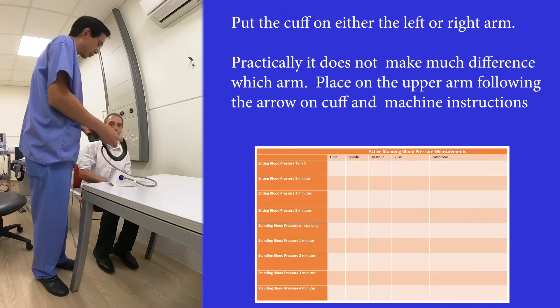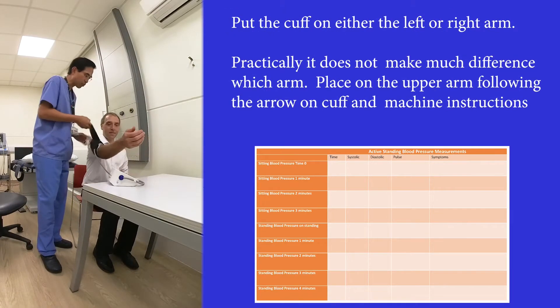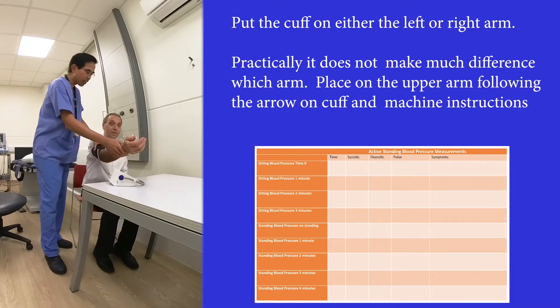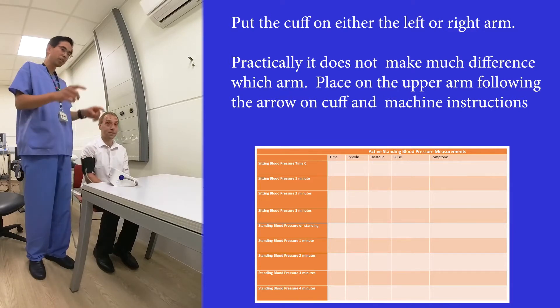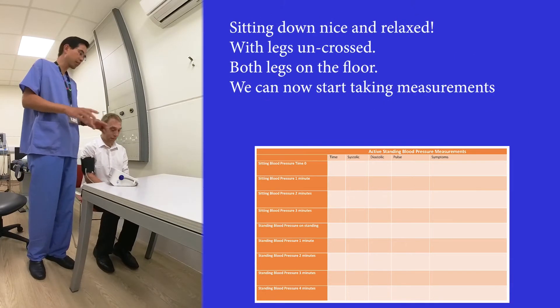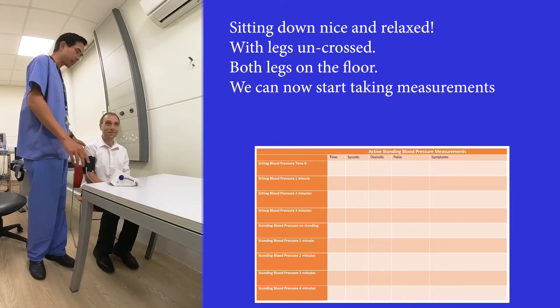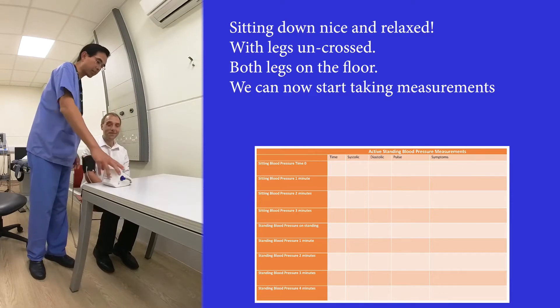We have a cuff that I'll ask Phil to put on his left arm — it can be any arm — and we'll put it across the upper arm like this, nice and tight. Phil is now asked to sit down, nice and relaxed, with his legs uncrossed and both feet flat on the floor, and we'll start taking a measurement.